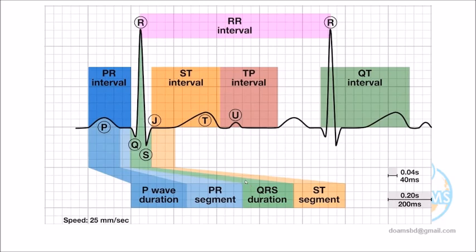From here, you see QRS. From the beginning of the Q and ending of, what I said, QT interval. It is written here. Sorry, I was gone. In this lead, it is shown here. From the beginning of the Q and you see the ending of the T. This is the interval. Beginning of the Q, ending of the T. We must remember it. Sometimes in the AKT exam, only a definition may be a question because these are too tricky.